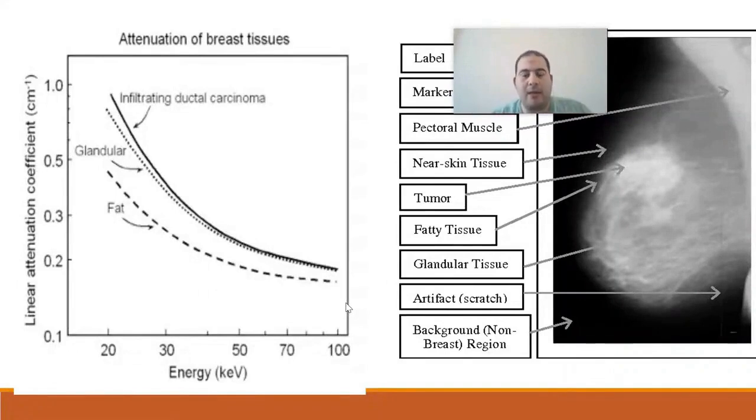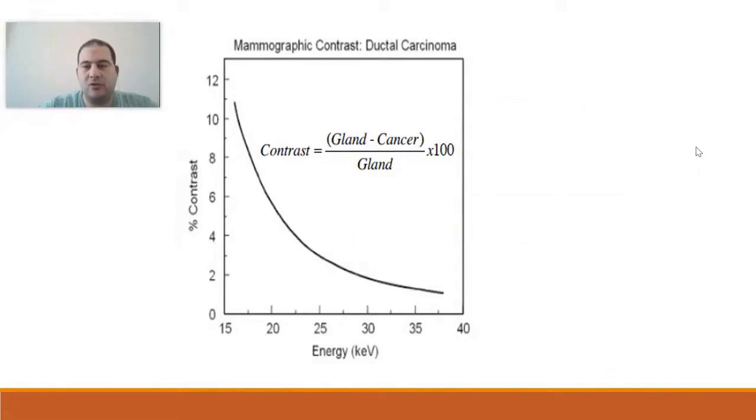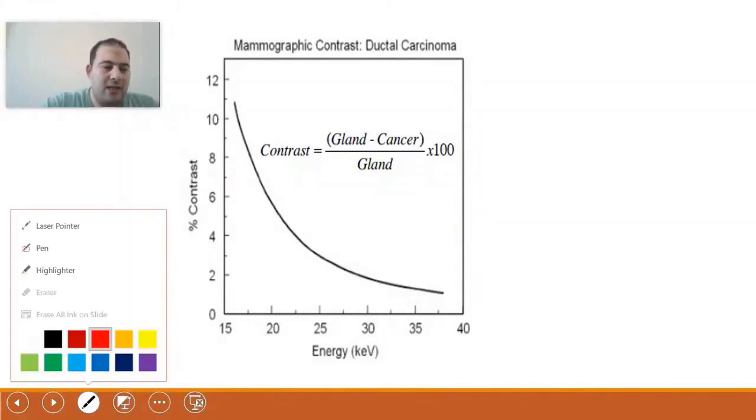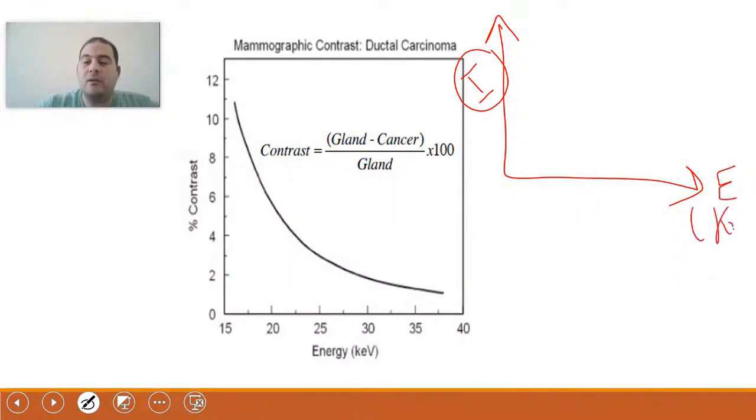When we go back to X-ray production and the things we talked about, let's talk about something called the X-ray spectrum, which is the relationship between the intensity of radiation, meaning the number of X-ray photons, and the X-axis representing energy in kiloelectron volts. The photons exiting the X-ray tube carry these energies. For example, 1,000 photons carry an energy of 10, while 50 photons carry an energy of 20, and so on. Thus, the number is not the same for every energy.